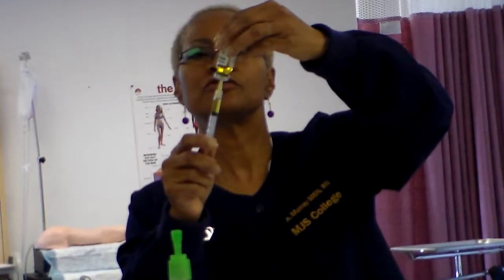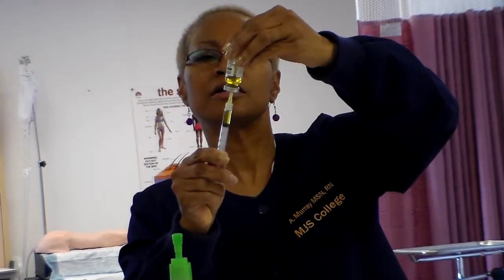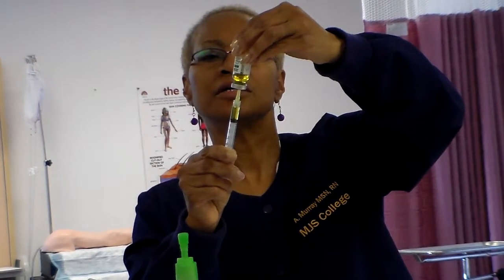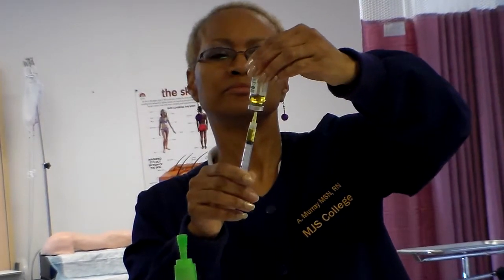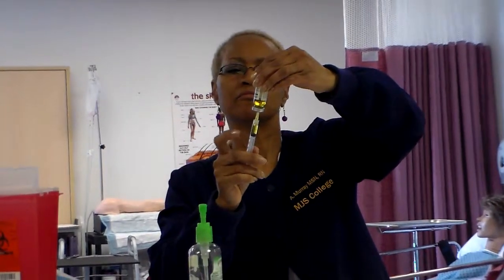Okay. When desired volume is obtained, position needle into vial's airspace. Okay, we're going to see if I can turn it so you can see the airspace. Here you go. Okay. Now I'm going to push the air out of it and go up to my required volume amount. Tap side of syringe barrel carefully to dislodge any air bubbles.